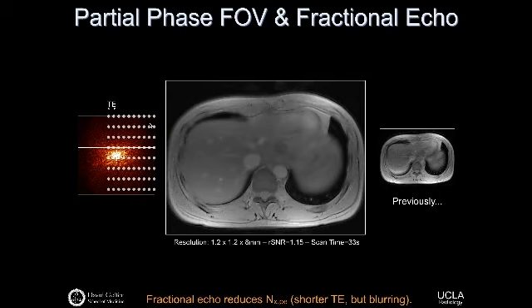Now, those fractional echo acquisitions don't really help us scan faster, right? We still need just as many TRs. We still have just as many lines of K-space, and it's acquiring the lines that really takes time. What does happen is our TE gets shorter. If your TE is too long, then fractional echo is one approach to shortening or tightening up your TE.